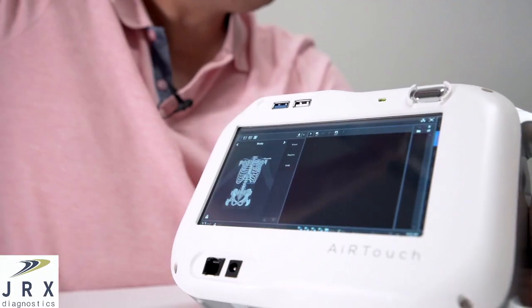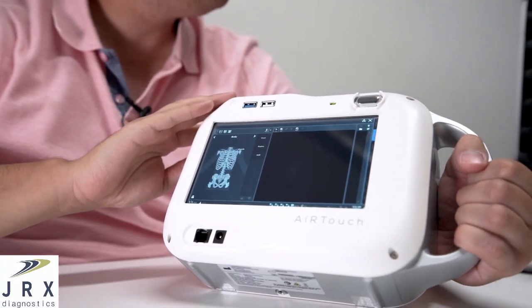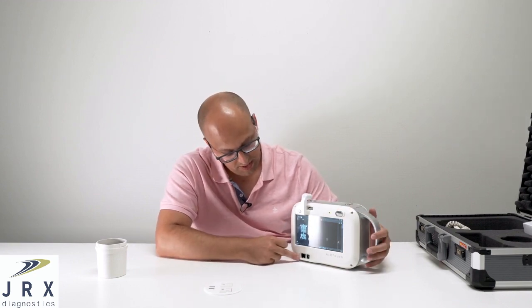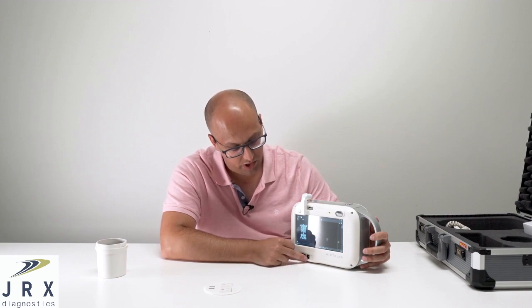Over here we have two USB ports — a 2.0 and a 3.0 — and we have a button here to take exposures if you don't want to use the hand switch. Down here we have two ports: one for the hand switch and one for your charging accessories.